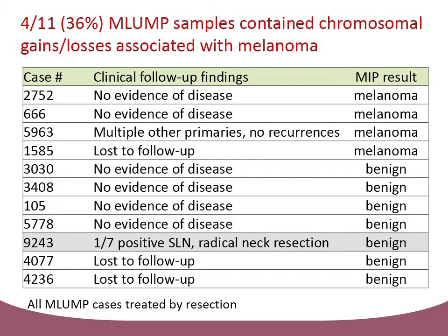I will note we did have one that had a benign looking pattern, but then did have a positive lymph node subsequently. So there does appear to be one sample that we had that did have a benign pattern by the microarray and yet did act more aggressively.